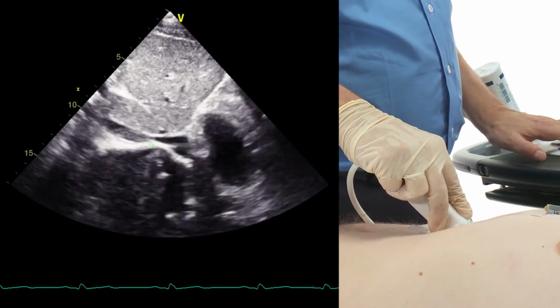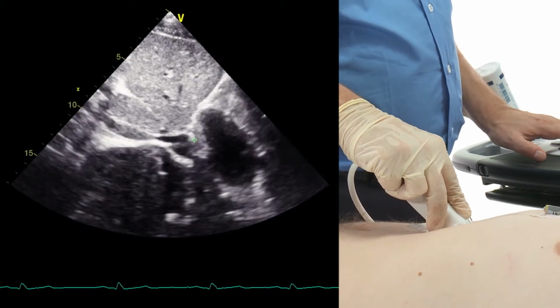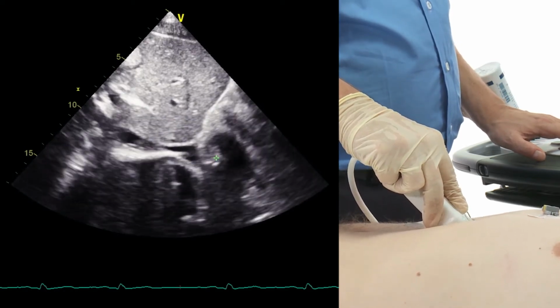You nicely see the fluctuations of the inferior vena cava, which are related to respiration. And if I let the patient inhale or actually sniff, you will see how it collapses. You see? This is information which will be very important when we look at fluid status. But this will come in a later chapter.